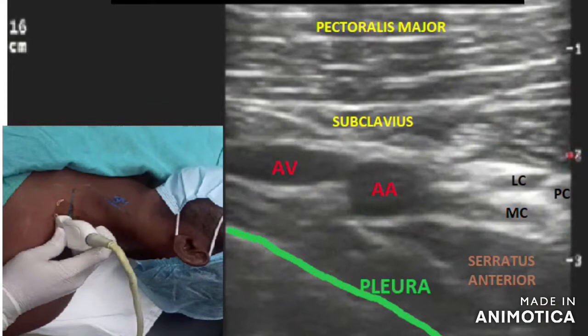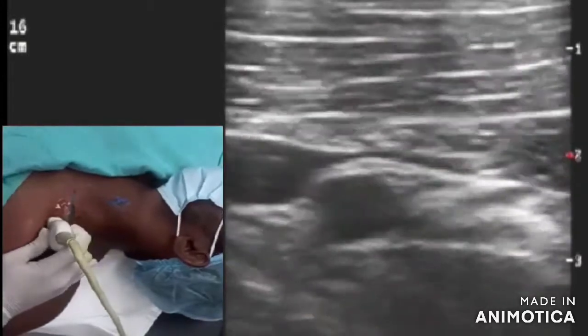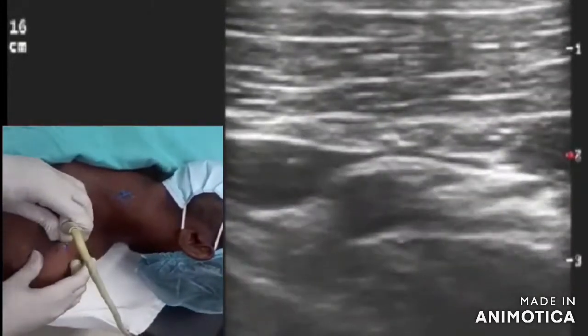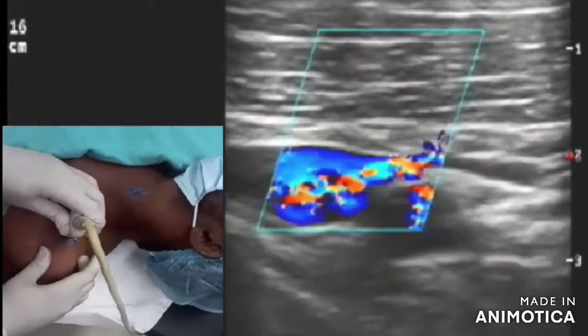This consistent relationship to the axillary artery is why the costoclavicular block is performed. Generally it is at the subclavius level that we do the block. Here you can see the serratus anterior muscle adjacent to the axillary artery, and the best region for the block is placement of the needle between the lateral cord, the posterior cord, and the medial cord.